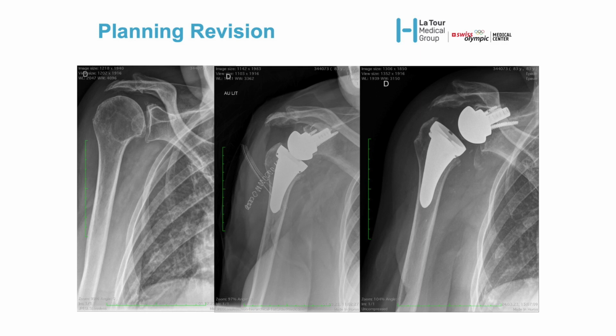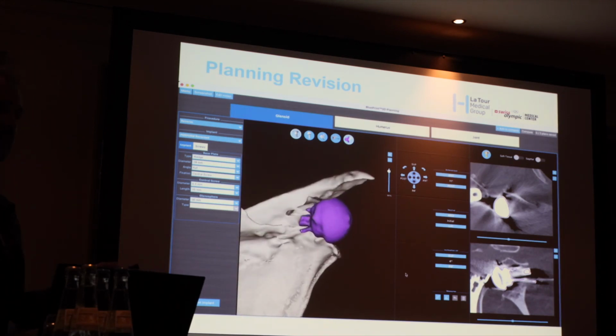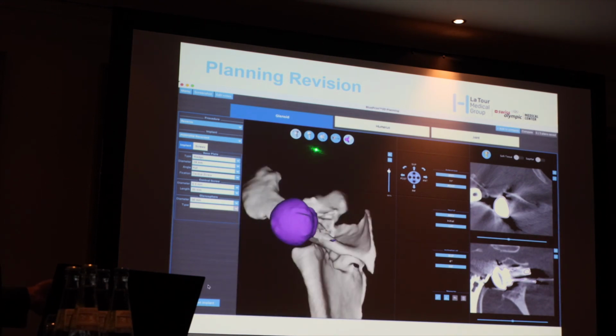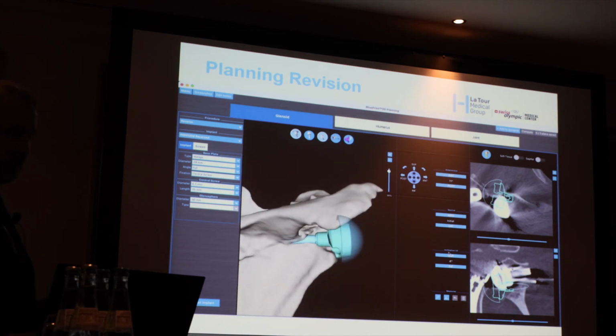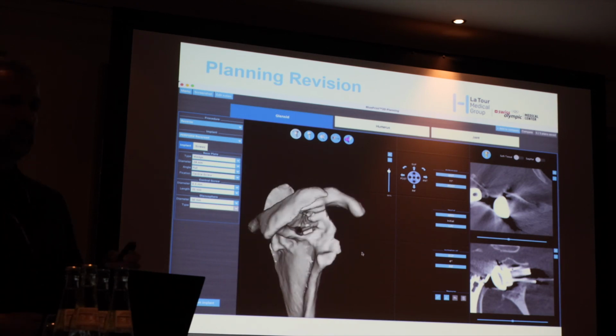I did this case Wednesday, so 2 days ago, a glenoid loosening in a patient with rheumatoid arthritis. And we can plan this kind of prosthesis. There is software today that allows us to see the previous prosthesis, and you can remove the prosthesis, maybe put another one. And if you remove everything, you will see that there is no more bone. Here, there is no more bone. Nothing. You don't have a posterior wall. So, okay, this is a planning.